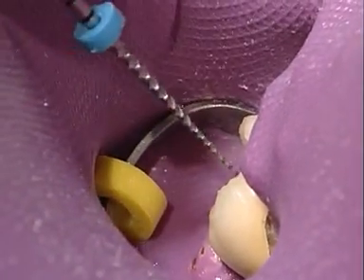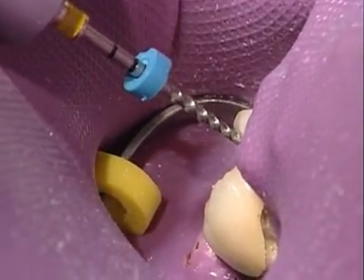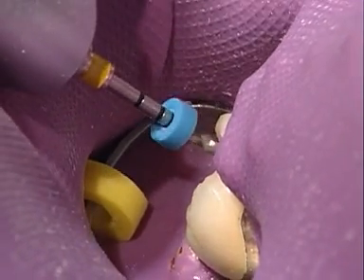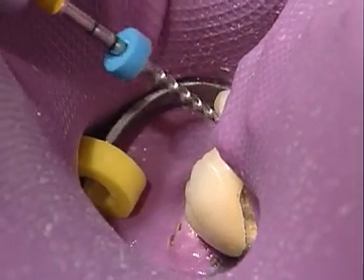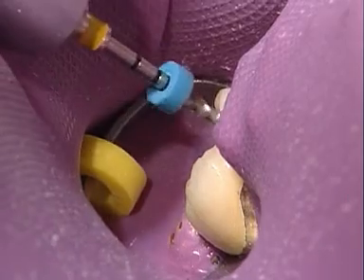When a file is blocked, the motor oscillates between forward and reverse direction until the file is freed. This is an additional protection against instrument fracture.